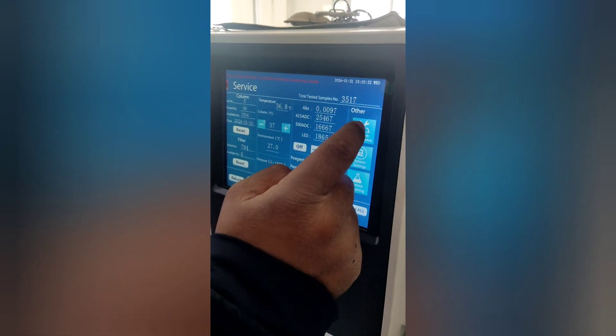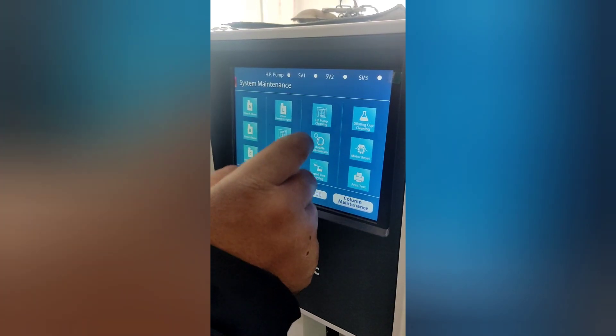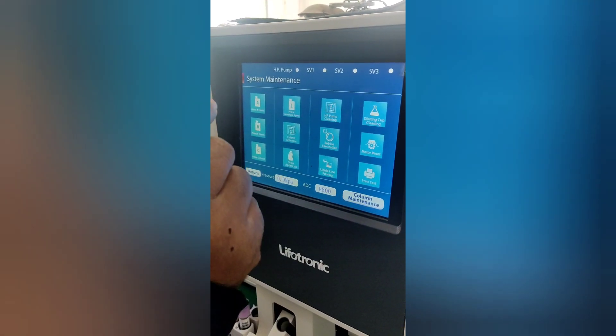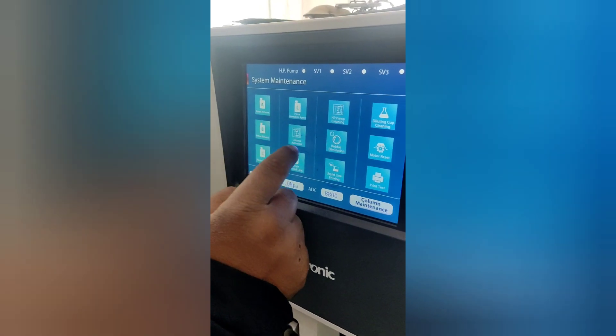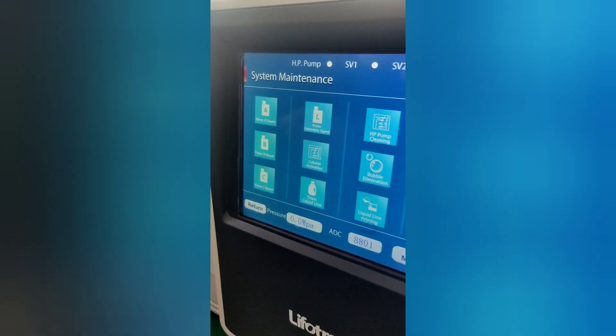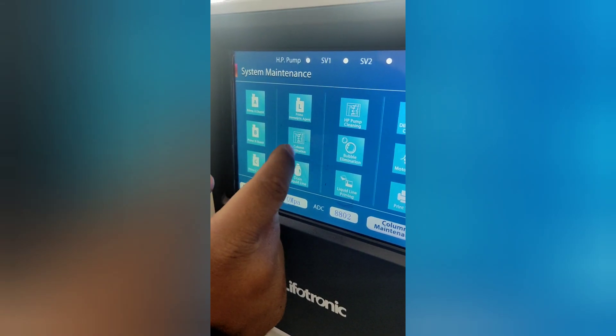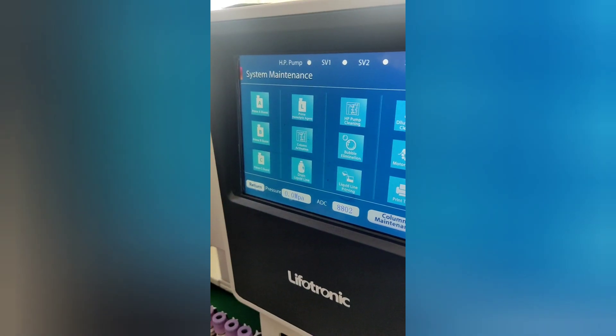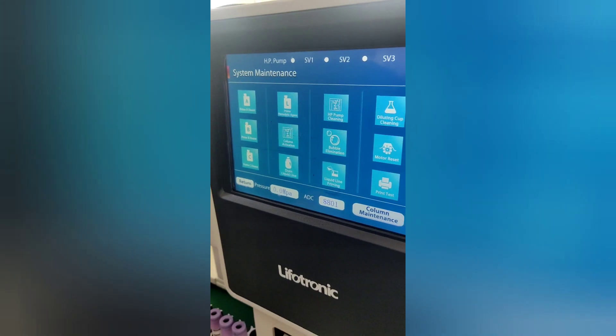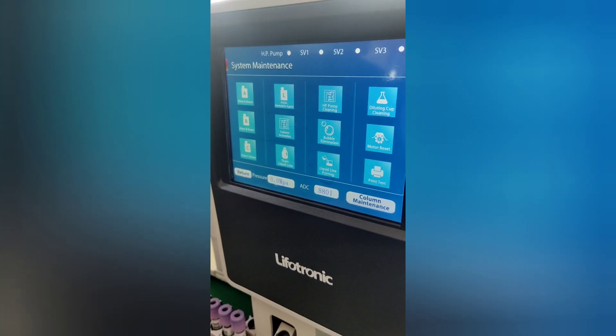Then we go to System Maintenance and click on Column Activation. It will prompt you to put the whole blood sample into the stat position. Do it accordingly and click Yes.